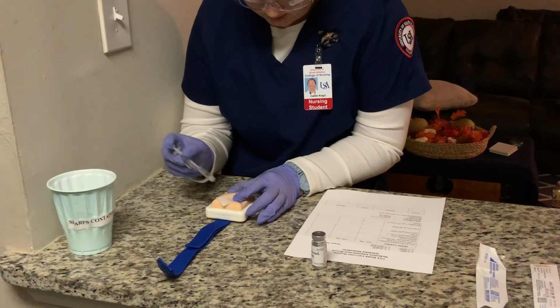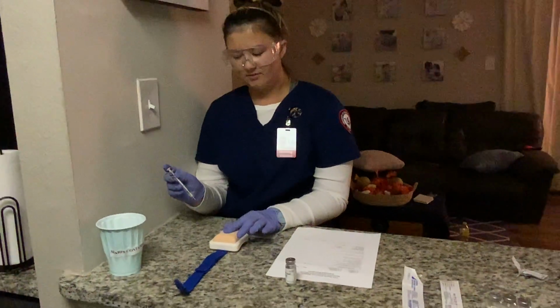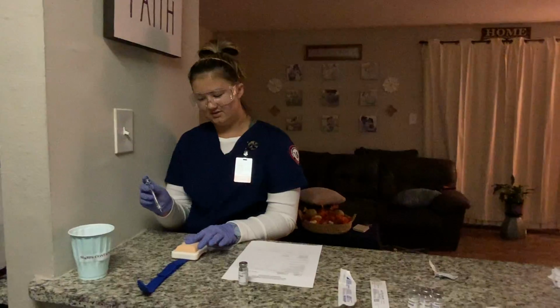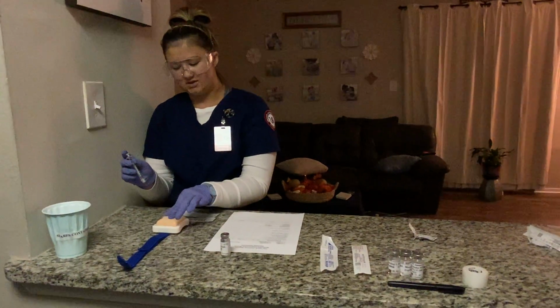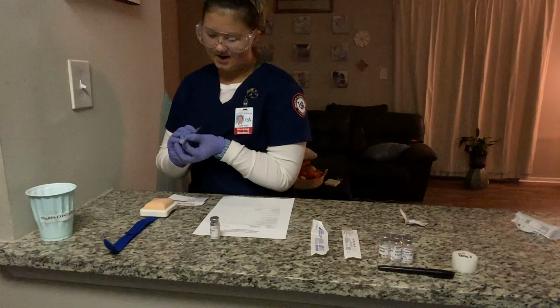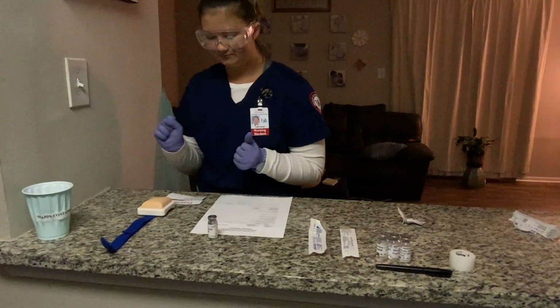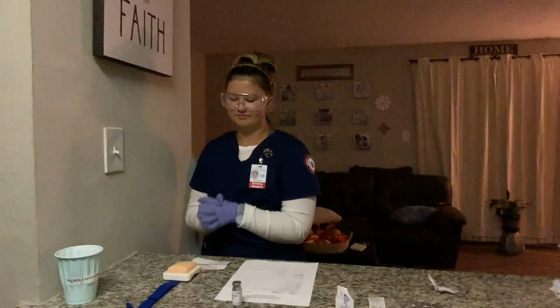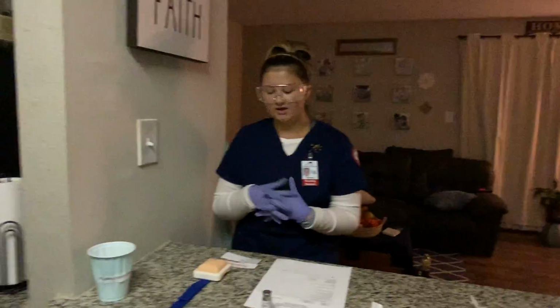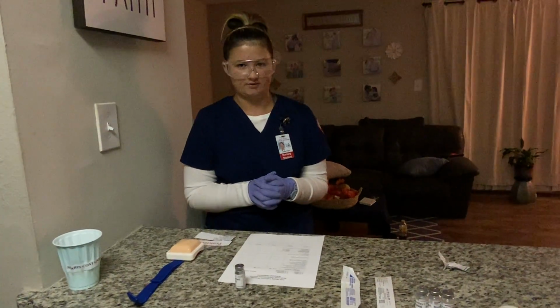Okay, and then once I administer the medication, I'm going to get my alcohol prep pad and apply minimal to no pressure, and I'm not going to massage the site. And once I do that, I will throw that away and then activate the safety device on my needle, putting it in the sharps container. And then once I do that, I'm going to position the patient to comfort by lowering the bed, raising or lowering any side rails, and assessing the patient for any allergic reactions.